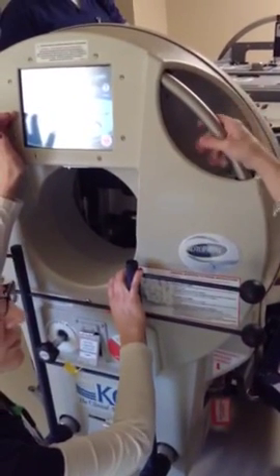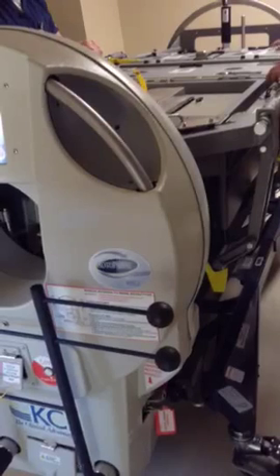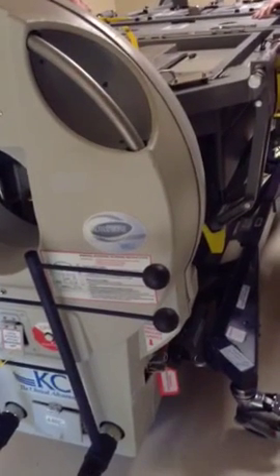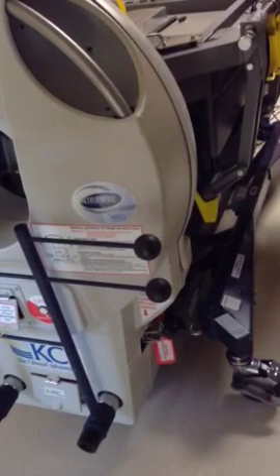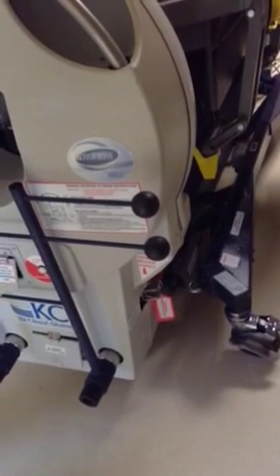So if it was a user error, which I've had happen before, where they manually supine the patient, and this hatch was still open, it would not let you turn the patient over. So there's a hatch that's open. When you have a 300-pound patient in here, and they're supine, lying on that hatch, there's no way you're going to get the hatch closed. So I've been in that position before, under the bed before, with the skirt on, trying to get the door shut. Okay, so if that happens, you can just override it.